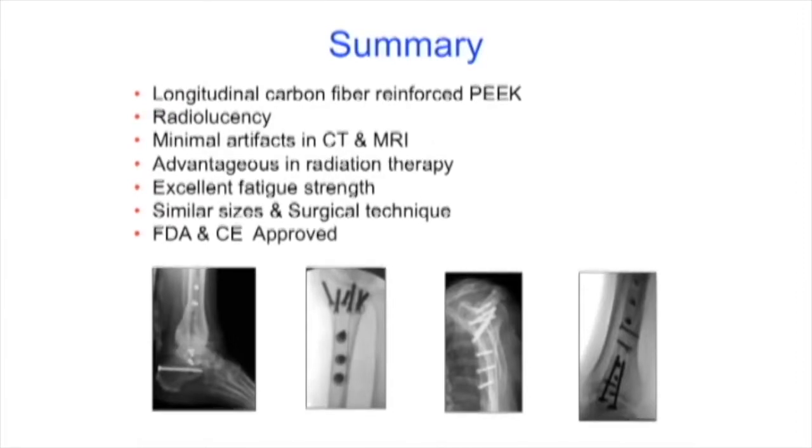And so the way that you get around it, if you were truly gung-ho about using this plate and not wanting to wait for the plate to bend down to the bone, is you could put a buttress plate on there still and put locking screws in. Granted, that's really heretical to an AO person, but it works, because you're still getting the strength of the plate against the bone in certain spots, and it's going to work if you're using locking screws. So, yeah, there are ways around it.